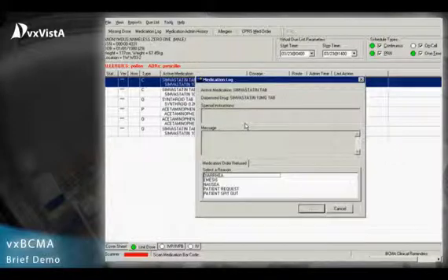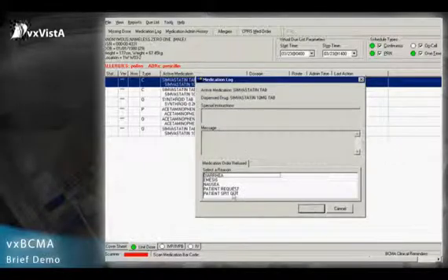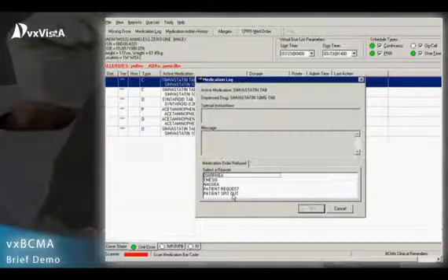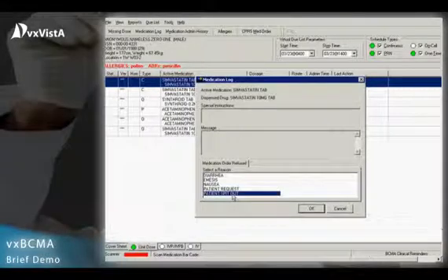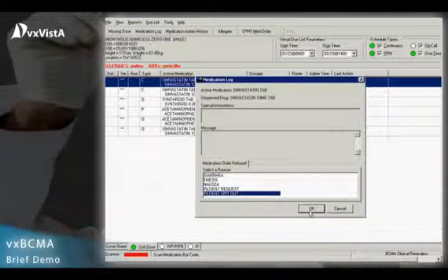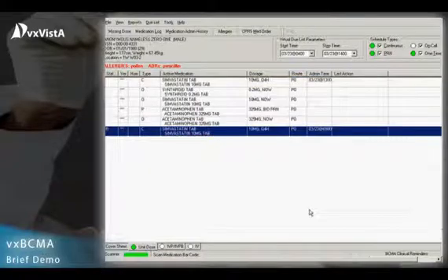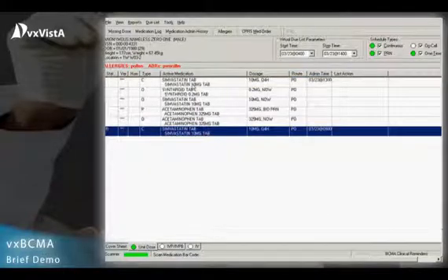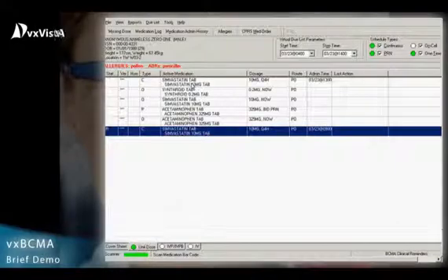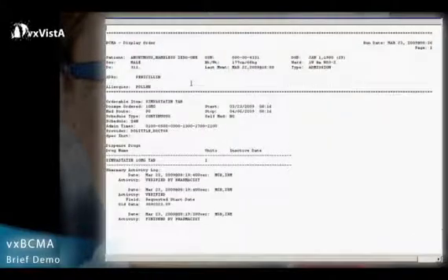The system displays a full medication history log and patient allergies. Nurses can view risks of drugs that need to be given soon and can log any dose that is not given for reasons such as patient refused or patient spit the pills out.